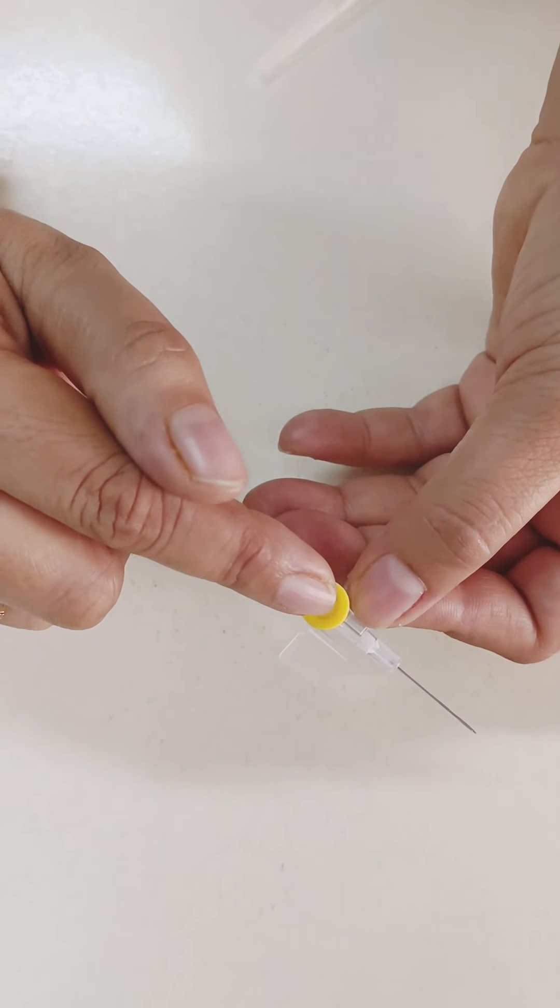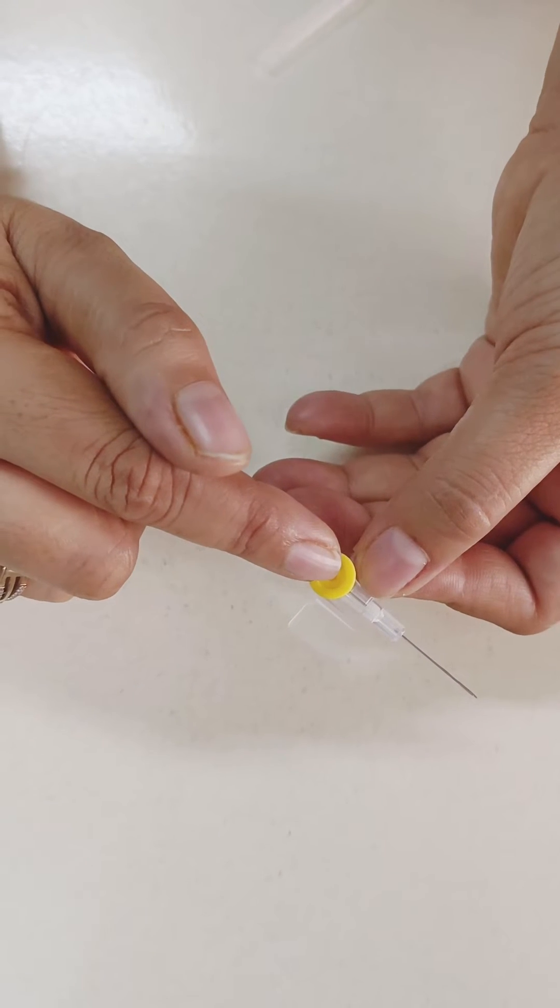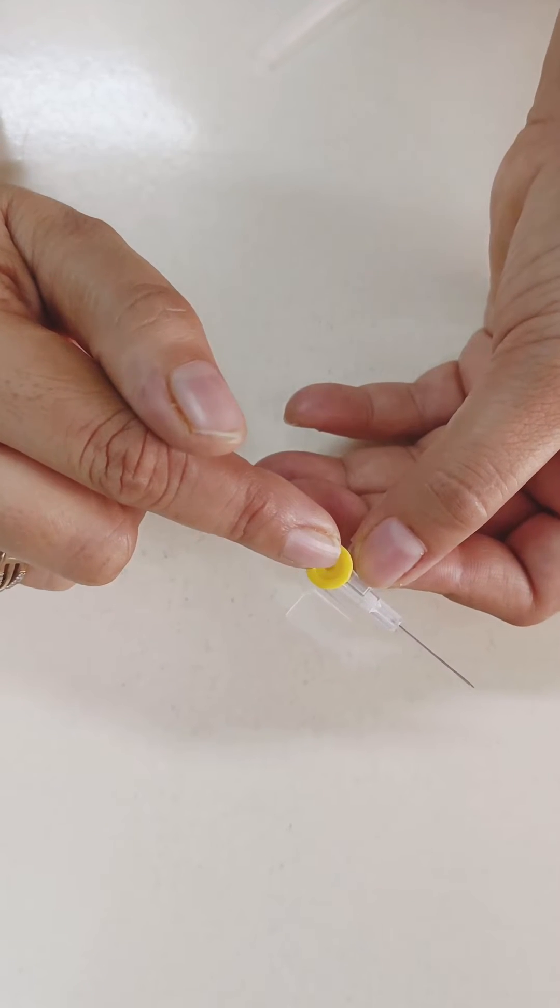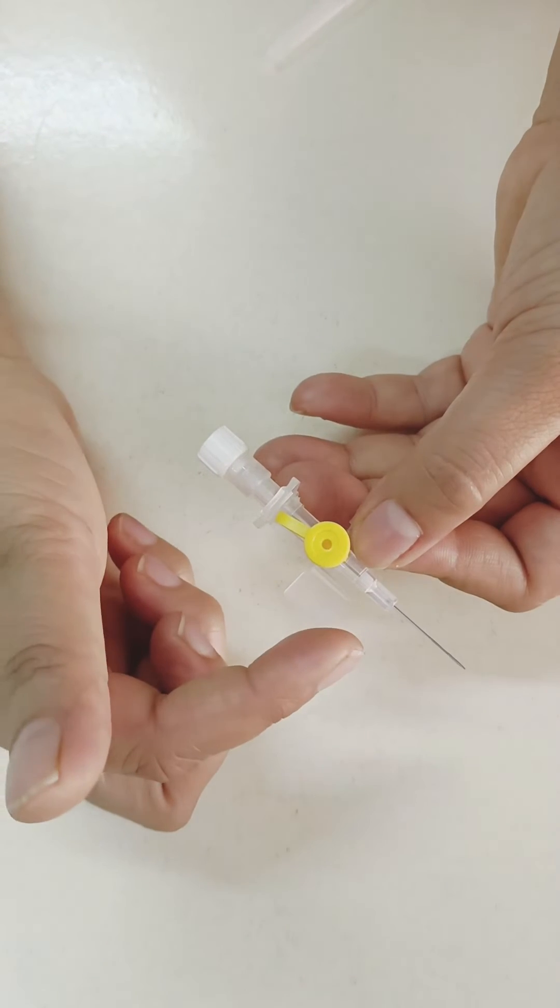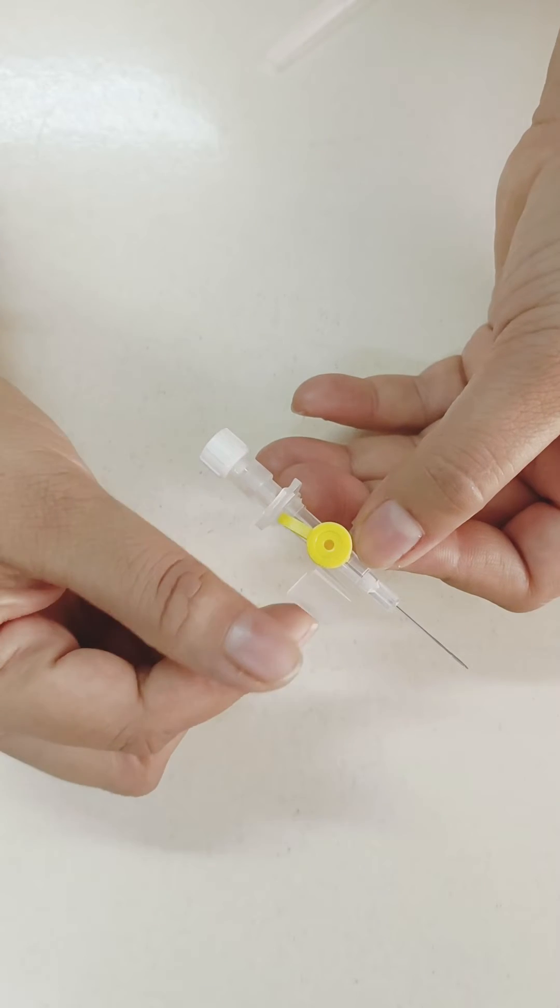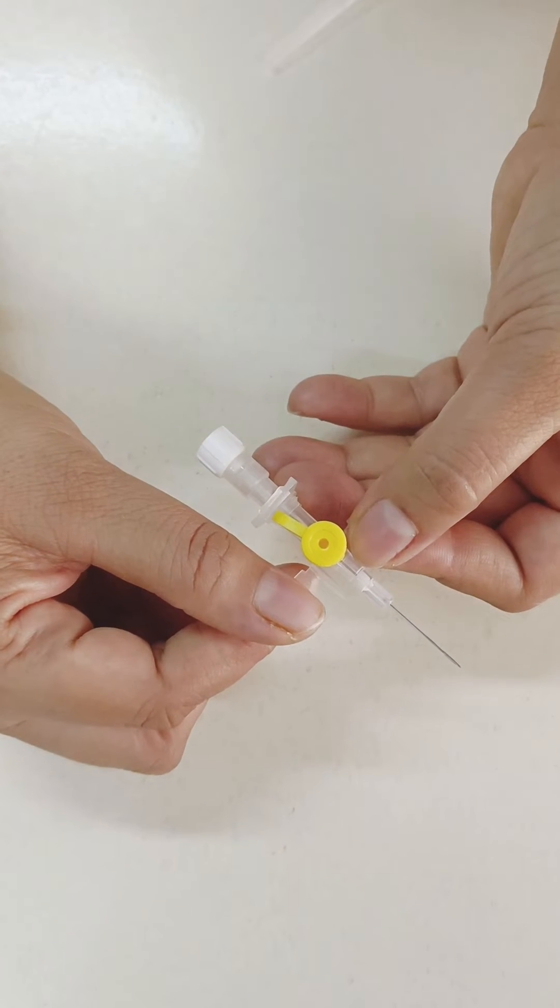This is yellow color, so it is 24g, external diameter is 0.7mm and length is 19mm and flow rate is approximately 20ml per minute.